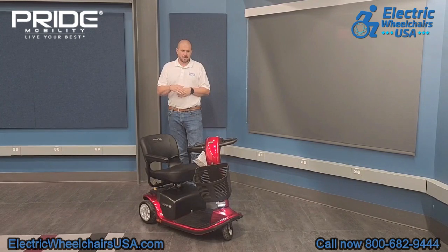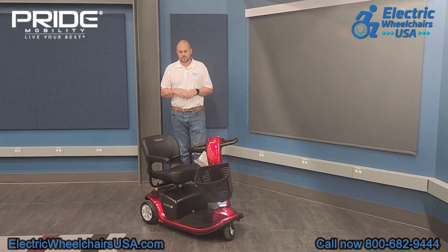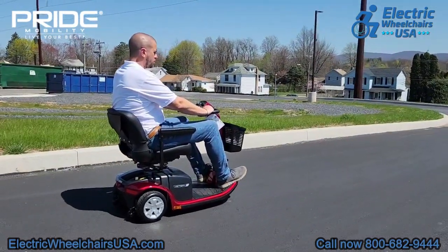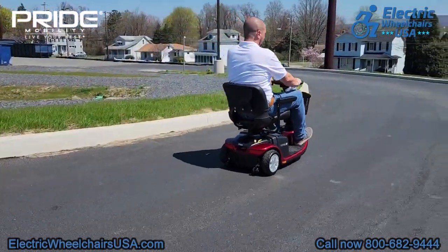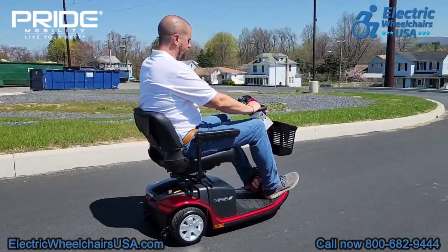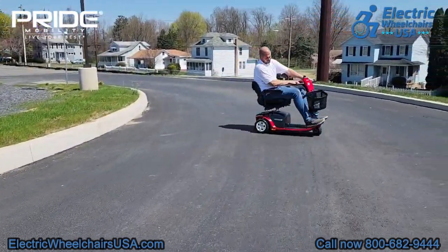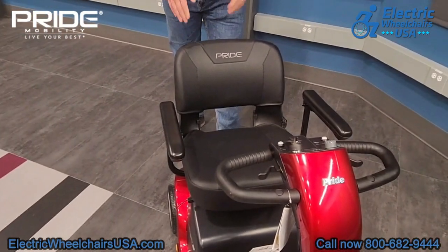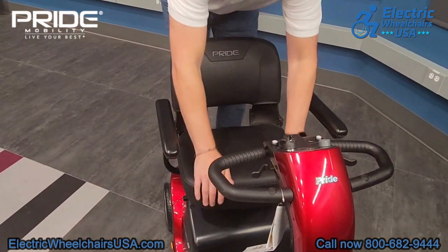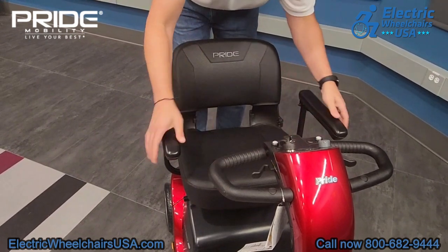It has a very comfortable seat with an upgraded Delta Tiller, and offers a 13-mile battery range and a top speed of just over 5 miles per hour. The seat is a deluxe stadium style seat that has a lot of padding, so it's more comfortable than your standard stadium style seat. The armrests even have a little hard padding on them as well, so a lot of comfort was put into mind when making this scooter.